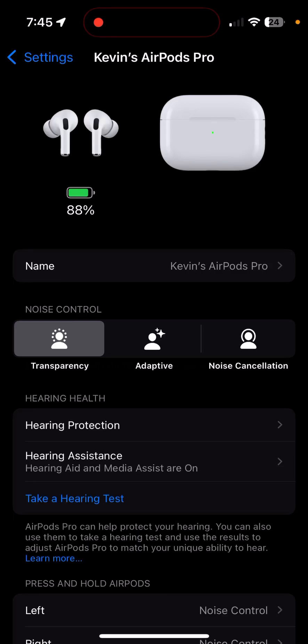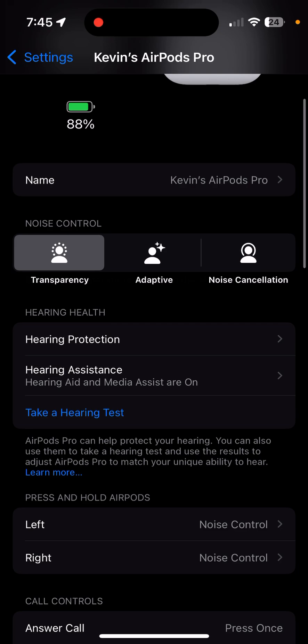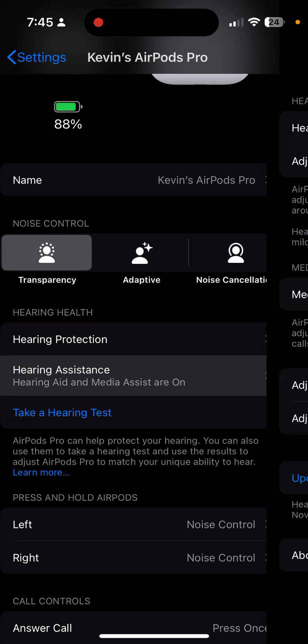This video is going to go over a little bit of troubleshooting for the Apple AirPods Pro 2 with the hearing aid feature. I've run into a glitch and wanted to demonstrate how to get around it and resolve any issues you're having with the hearing aid. This is going to presume that in hearing settings and AirPods, your hearing assistance — the media assistant hearing aid — are turned on already.